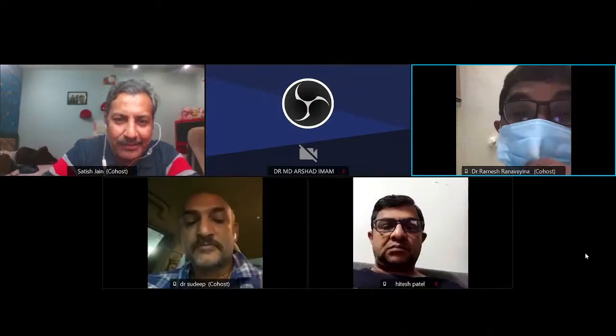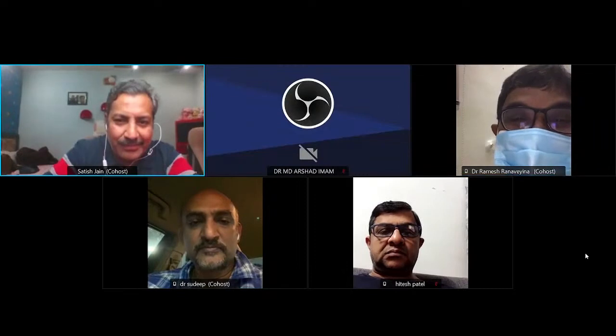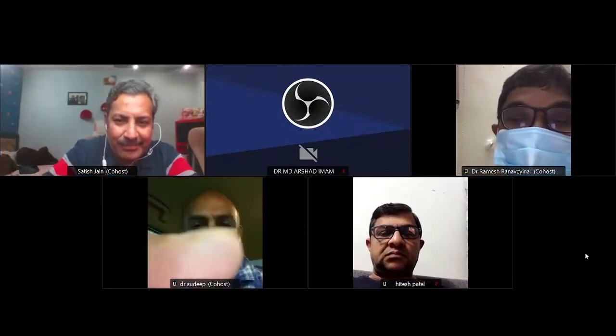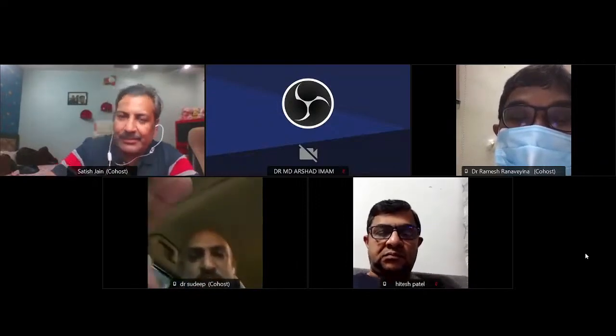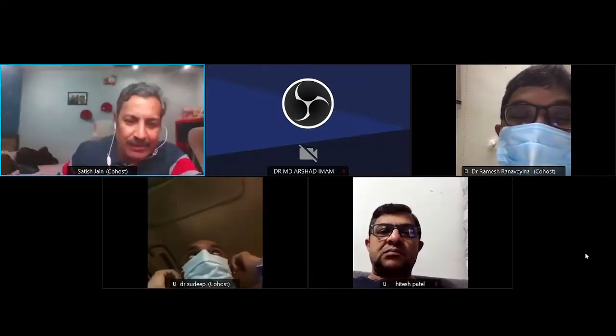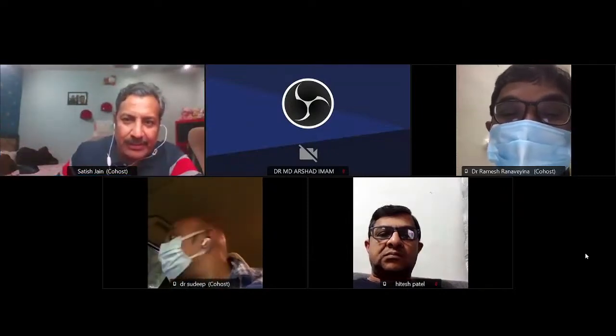Hello, good evening, sir. It's a very good presentation, sir. Very excellent demonstration of the things, sir. And my question is, please show the frontal recess drainage pathway once again, sir. You have shown already in axial cuts. Just in axial cuts, sir. You have shown the medial drainage pathway. Yes. I want to see that one again.